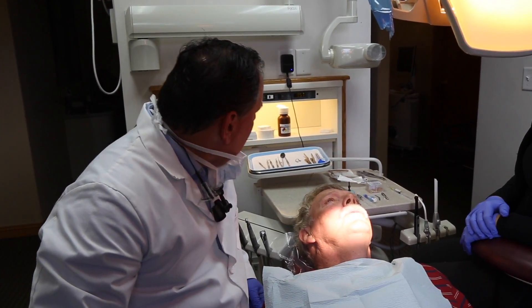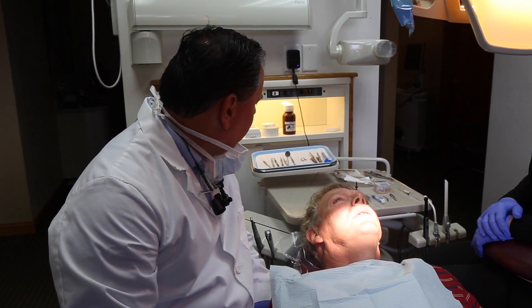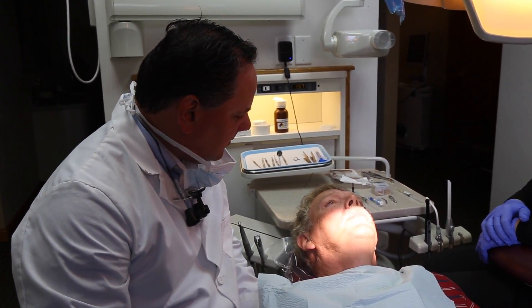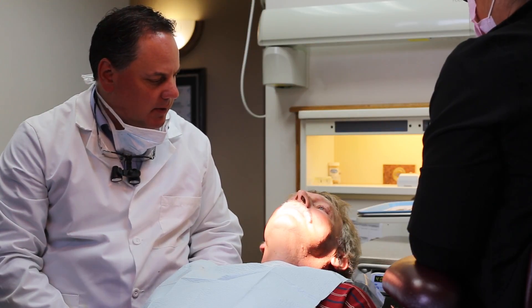How long does it last? It usually lasts about 45 minutes to an hour for the half ml that I put in. So after I leave it goes away pretty fast? It does — it depends how active you are to some extent. But absolutely, it'll stay in there.